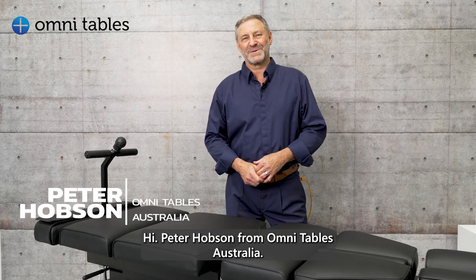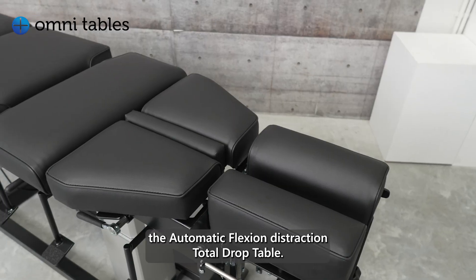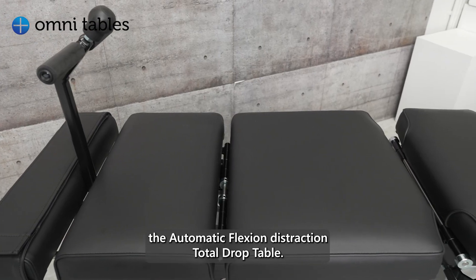Hi, Peter Hobson from Omni Tables Australia. Proud to announce the new member of our Omni family: the Automatic Flexion and Distraction Total Drop Table.